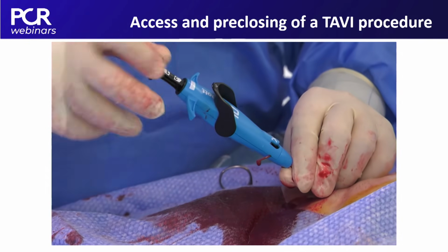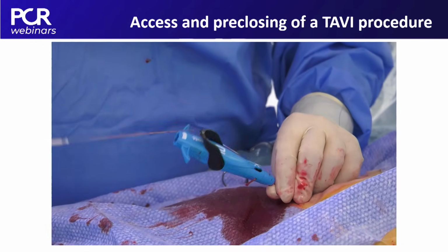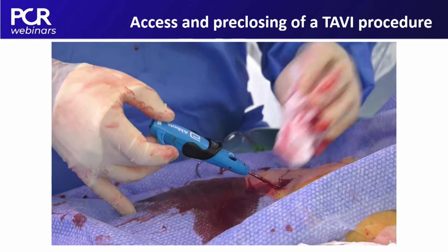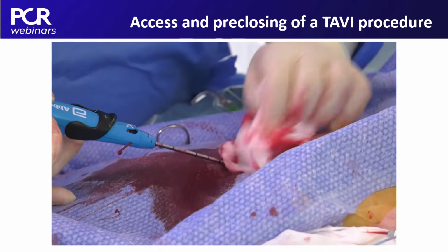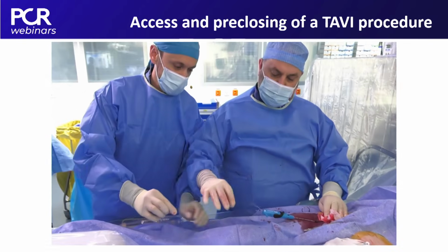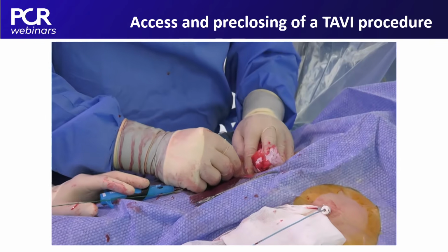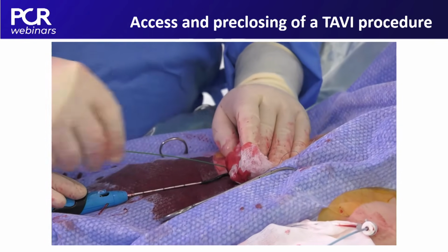This is the puncture. Typically, you don't have this recoiling of the needle like you have sometimes with the ProGlide, because the needle material and structure have been improved. And now, since this patient has a really straight vessel, we carefully introduce the stiff wire directly in the Prostyle in order to then put the 14 French sheath that we are going to use for the predilatation.